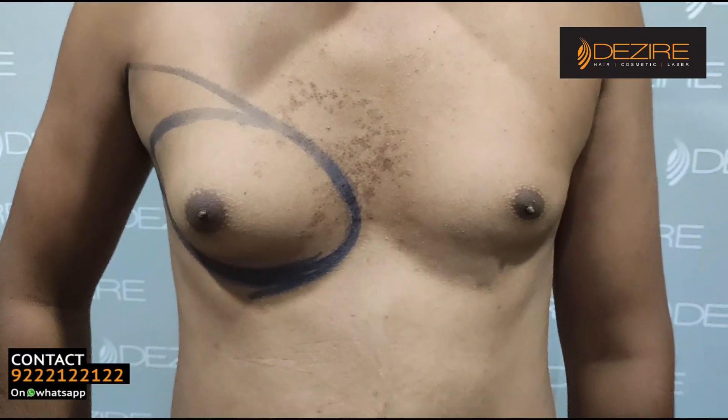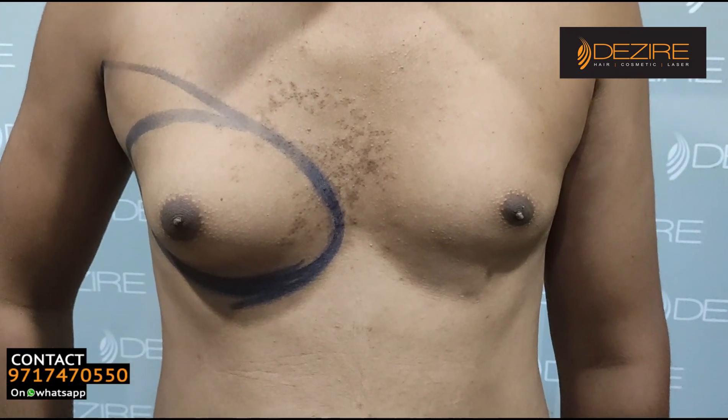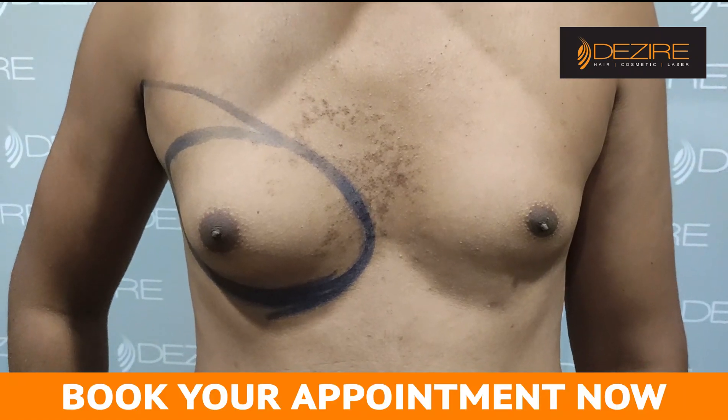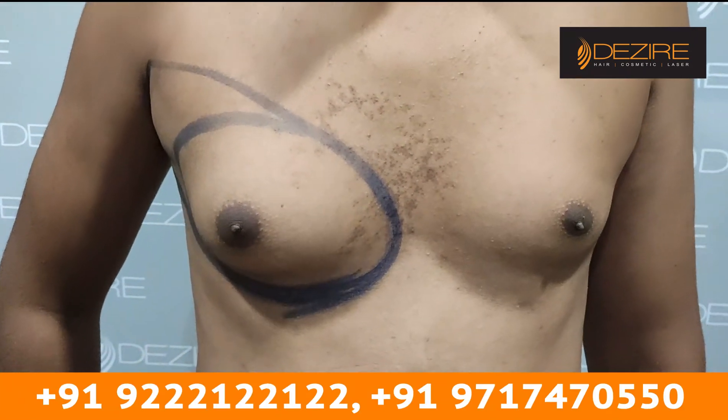This is the procedure. I am seeing one-sided gynecomastia. We are using laser liposuction and gland removal. Both sides will be made symmetrical and the same shape — we will try to make the same size and symmetrical shape.